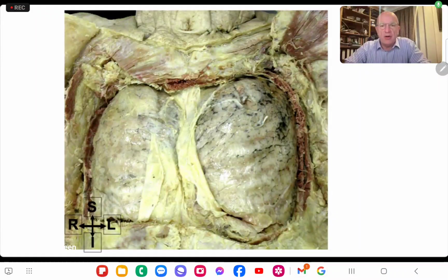The chest wall off, you don't really see the heart, do you? That's what you see. And the thing that you see mostly is lungs. And the problem with lungs is, as you know, ultrasound, which is a high frequency sound wave, doesn't pass through air where the molecules are spaced out, so you can't take an image.